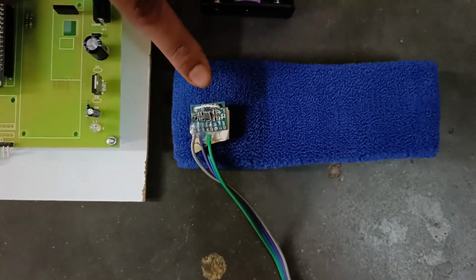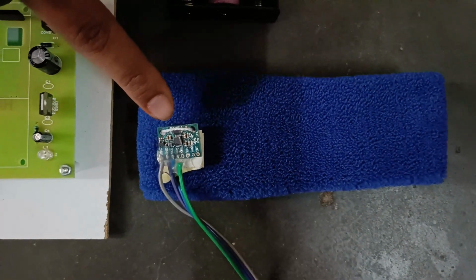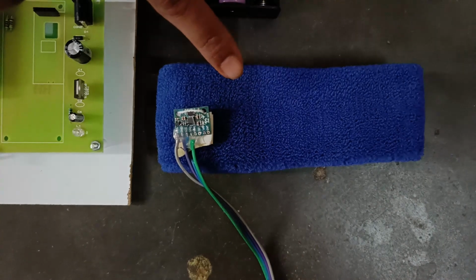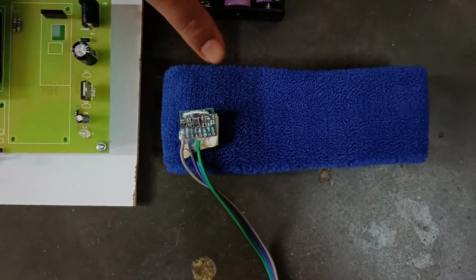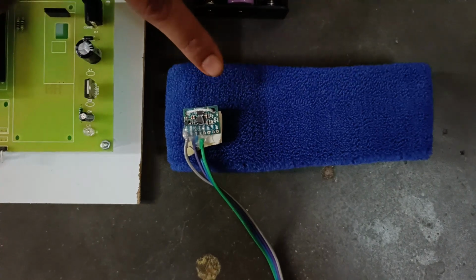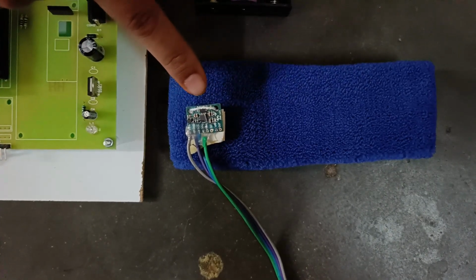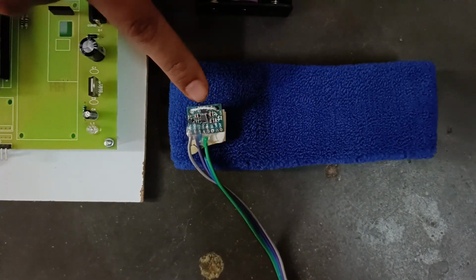Whenever the accelerometer gets the power supply, it starts detecting the angles. It is attached to a headband which will be worn on the head of the quadriplegic user. So the person wears this headband with the accelerometer. Whenever the person tilts their head or makes a head gesture like forward, turn right, turn left or tilt backward, the accelerometer detects values, as the angles change in the XYZ directions.